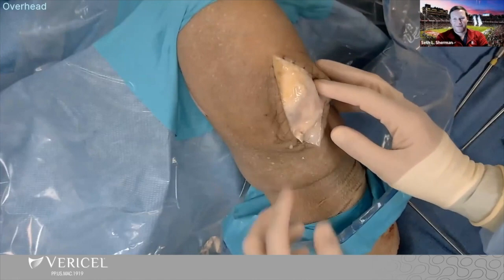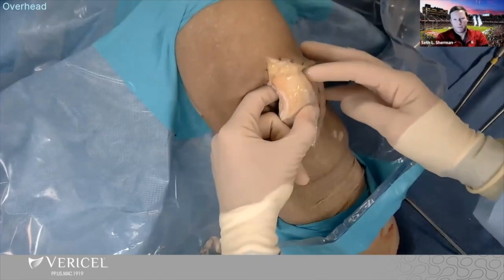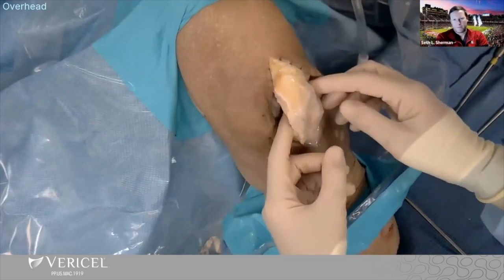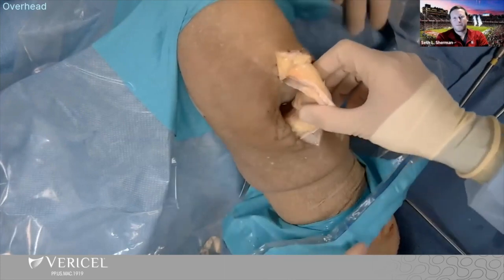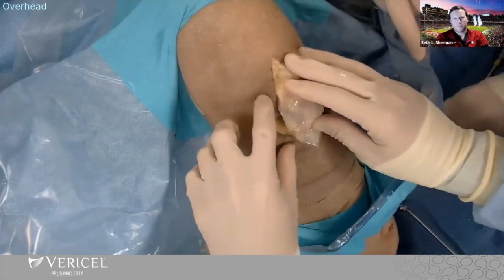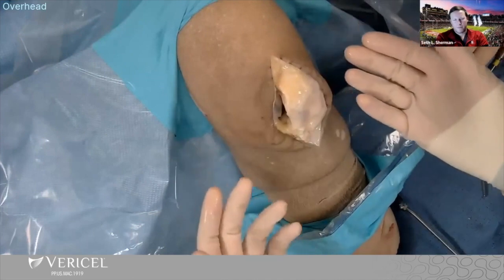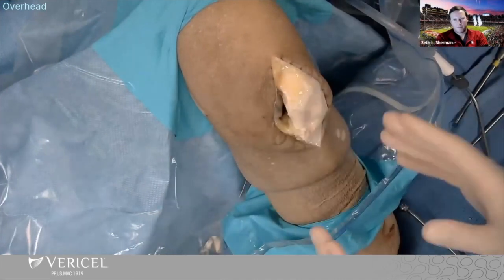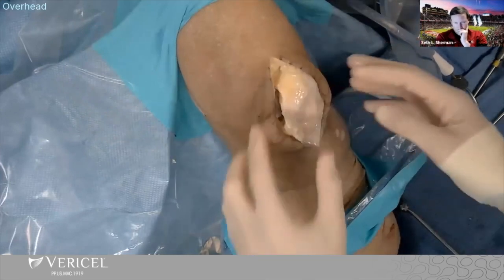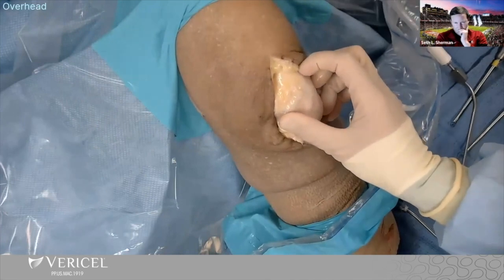If you do a patella especially — and we're going to do a trochlea here — you can do an open lateral release. Arthroscopic is great, but these open releases you can get a lot more mobility and better access. I can make a much smaller incision and flip the patella if I just do a small lateral release. If you just stay on the medial side, you won't be able to access that nearly as well. With a central trochlear defect I will go medial; if it's more laterally based I'll go lateral. I adapt to whatever allows the smallest incision while still being successful.